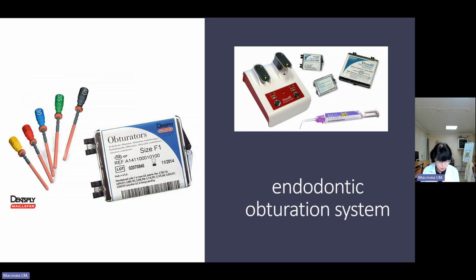The dentine should be cleaned mechanically with small burrs and then washed with alcohol. A normal acid etch and rinse technique may then be used, resulting in a resin-dentine bond as strong and reliable as if the eugenol temporary cement had not been used. A temporary filling material which is based on zinc oxide and calcium sulfate is another alternative.